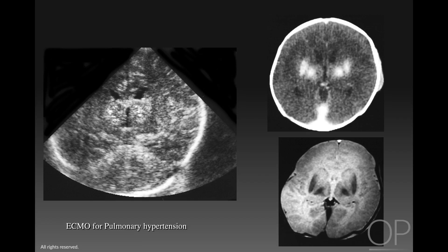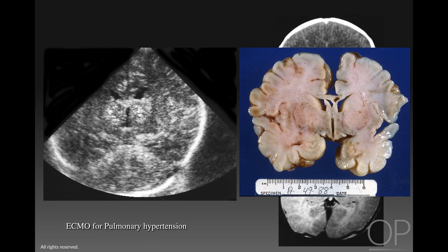This child has very similar echogenic lesions in both the putamina and globus pallidus, as seen on ultrasound and postmortem CT and MRI. This child was treated with ECMO for pulmonary hypertension, and at pathology we expected to see focal hemorrhages. However, there was no gross abnormality, and only on microscopic analysis did we see that these were related to microcalcifications. Microcalcifications can occur secondary to ischemia after one to several weeks post-insult, resulting in diffuse and focal echogenic lesions throughout the deep white matter.